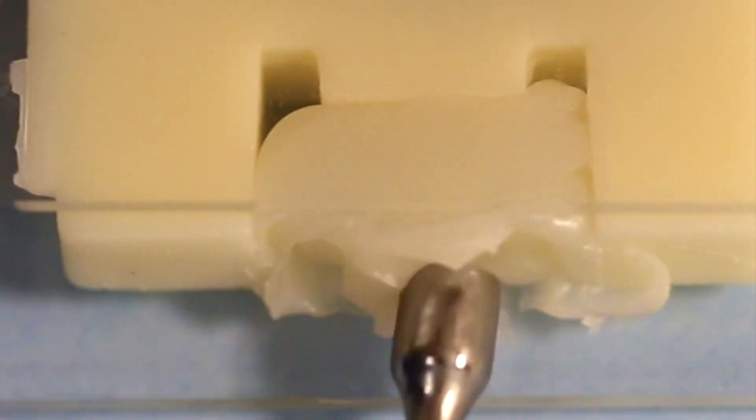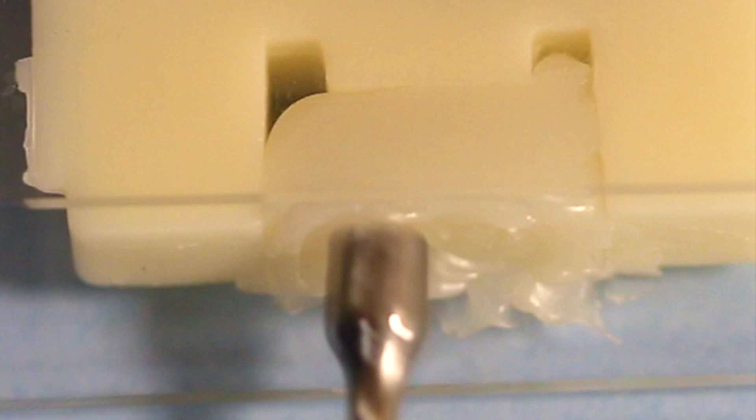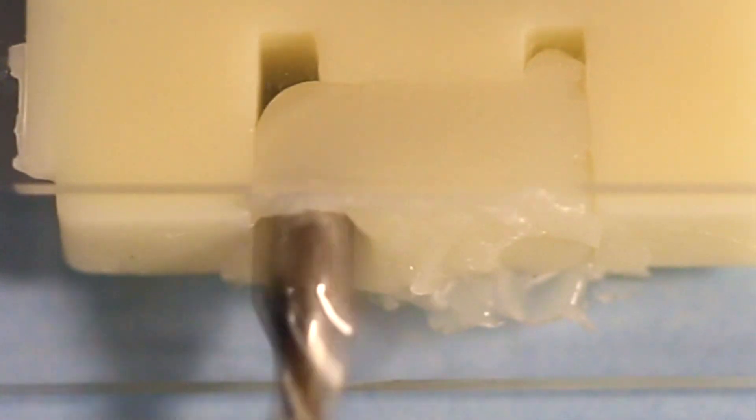And the point I want to make here is that composite, unlike amalgam, cannot be condensed. When you push on it, it just kind of smushes to the side.